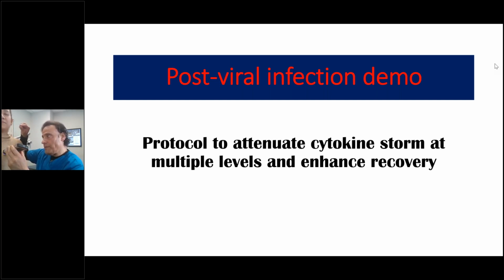apex of the lung, middle portion of the lung, lower portion of the lung. She would just turn around, and that's fine. Apex, middle, lower, each 30 seconds, and then I'll sweep the pleural area. Turn around. Now I'm going to show what I call my vagus nerve stimulation.